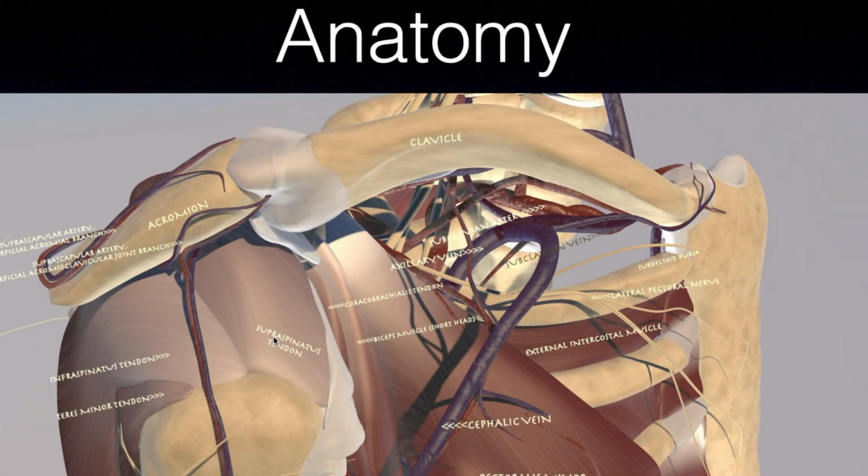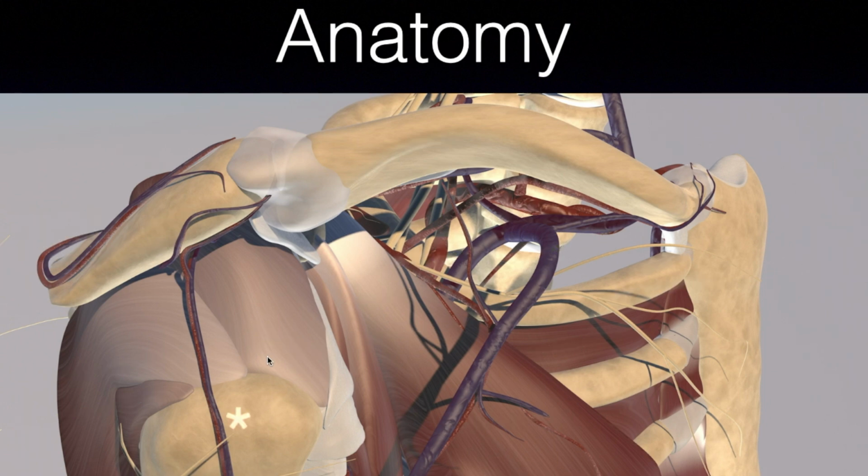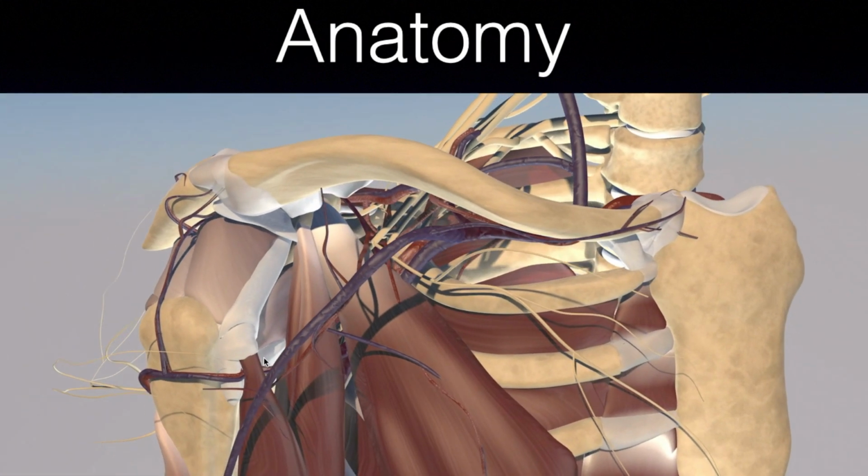You can appreciate, again, the supraspinatus and infraspinatus tendons. This is not completely accurate, as we were just talking. There is overlap of the infraspinatus on top of the supraspinatus. I think it's just very hard to tease out exactly how that happens when it inserts.